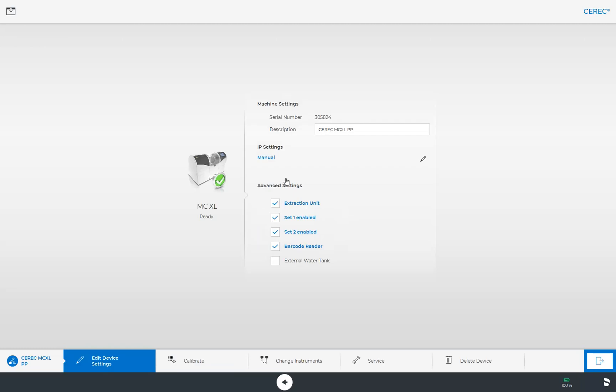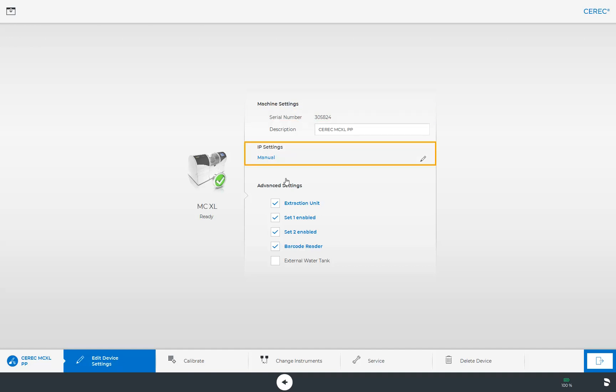And a new window with the machine settings for the MCXL opens. Here, you can retrieve the serial number and check the IP settings or correct them if needed, as well as the advanced settings such as enabling or disabling suction.